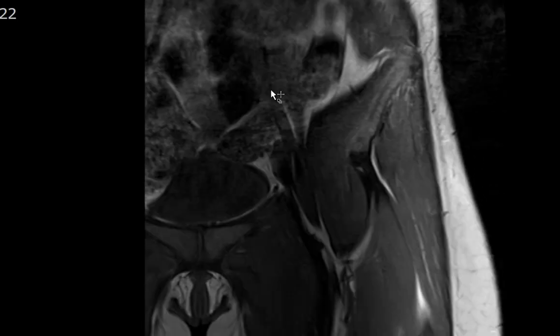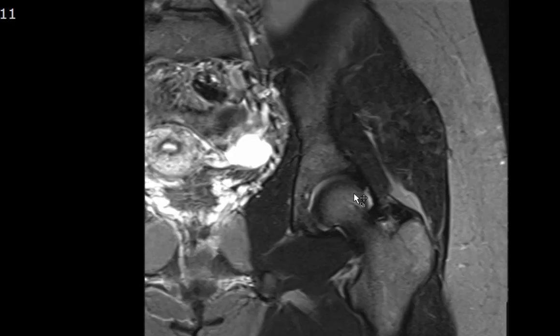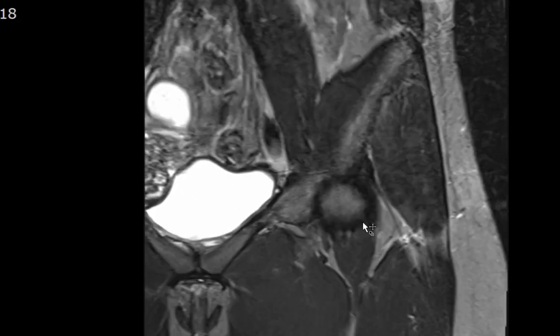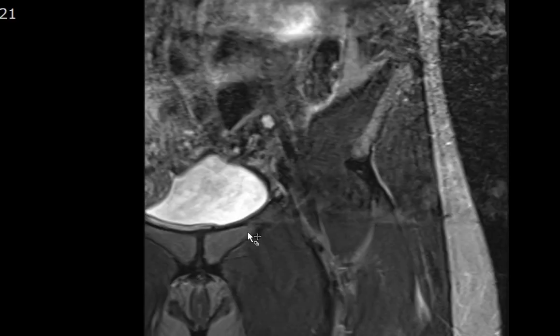Everything on the T1-weighted image looks great. I then turn to the coronal STIR or T2 fat-saturated weighted image, looking for any marrow edema. There is no associated marrow edema within the femoral head, femoral shaft, acetabulum, or sacroiliac joints. The marrow itself looks totally normal — no marrow contusion or fracture.